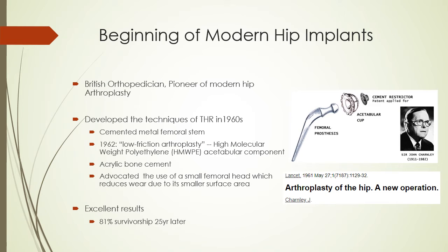To talk about modern hip implants, we can't skip talking about Dr. Charnley, a British surgeon who was the pioneer of modern hip arthroplasty. Dr. Charnley developed the techniques for THR back in the 1960s, and a few of his proposals are still the foundation of the modern hip arthroplasty.